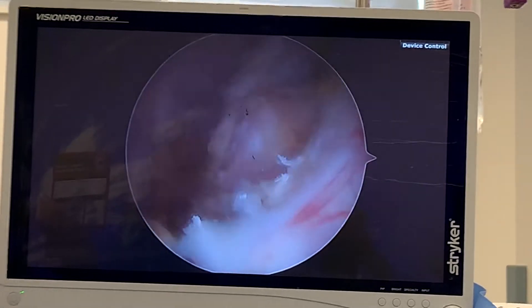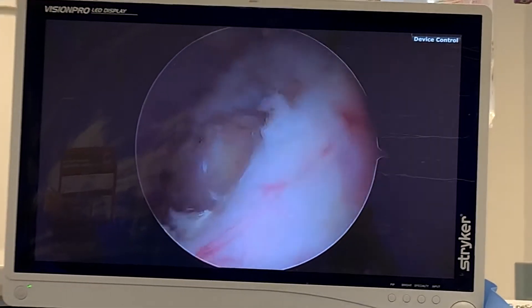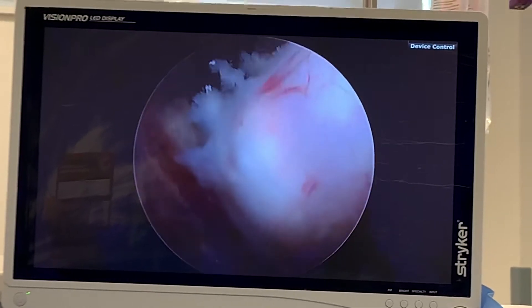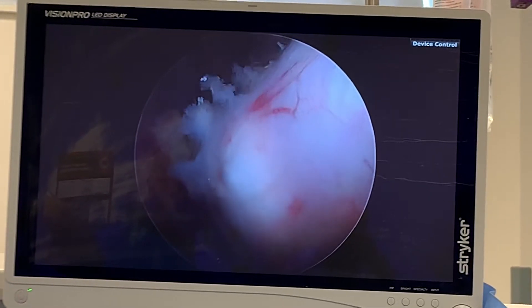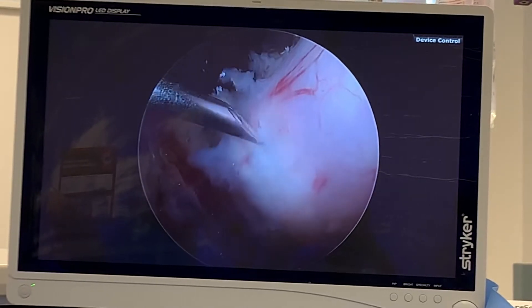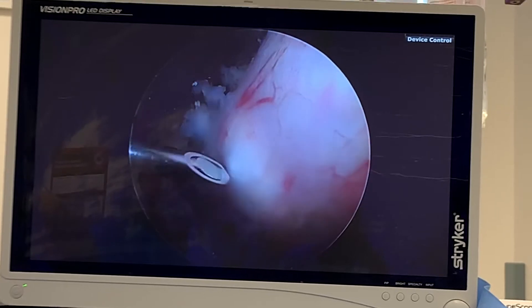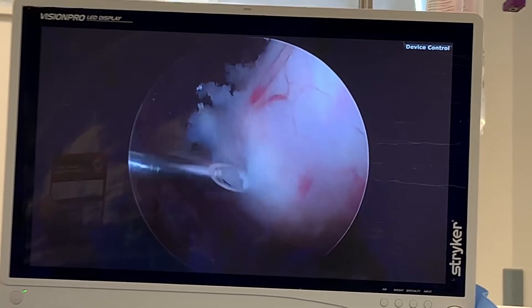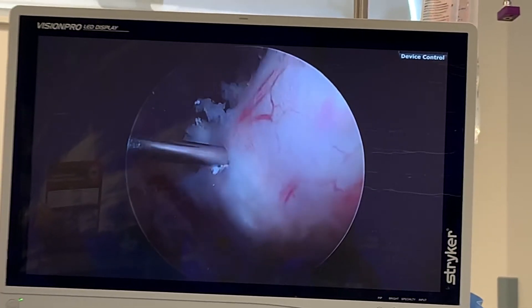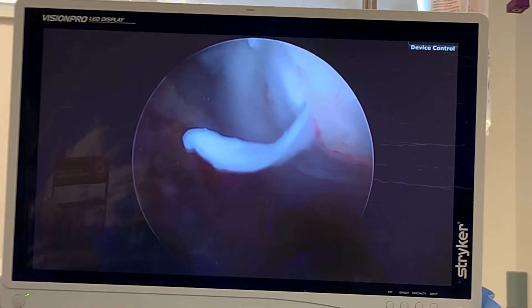We're gonna get that later. So I'm going to decompress this calcification right there. You see that little sort of blister right there — there's something in there because normally the cuff doesn't look like this. So what I'm going to do is just kind of go like this — look at that.